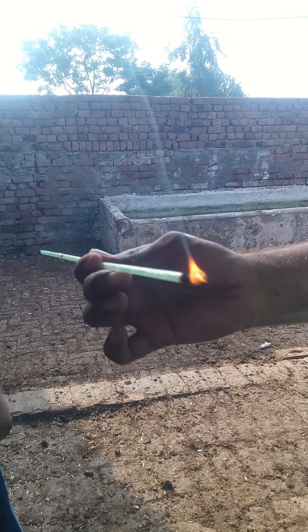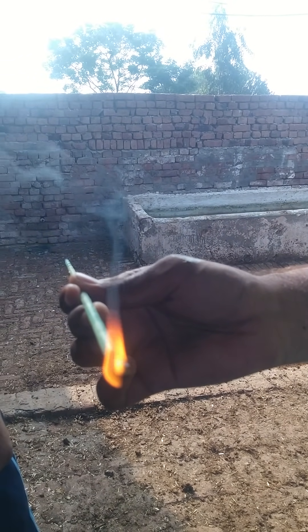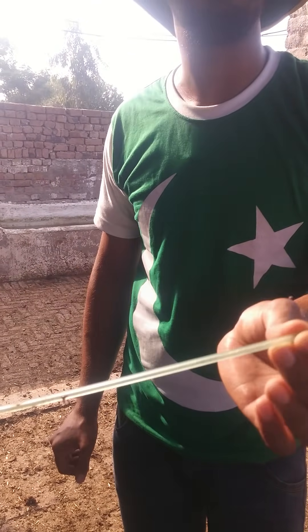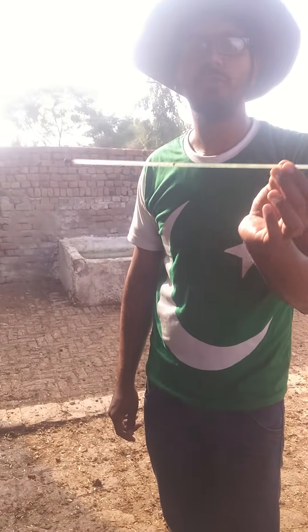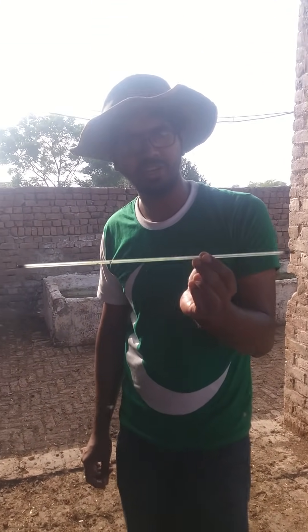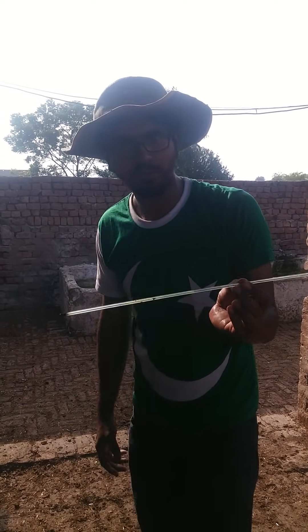You can see that the opening is closed now — there is no opening. Now you can send this sealed rod containing the debris, the pus, and the uterine fluid to the laboratory. They will use this fluid for culture sensitivity or for the isolation of organisms, anything you want to confirm. Thank you very much.